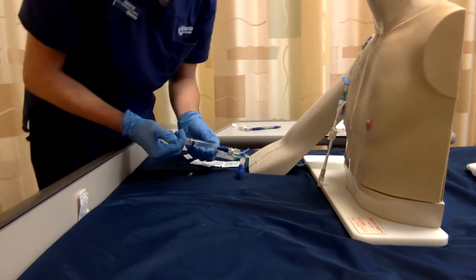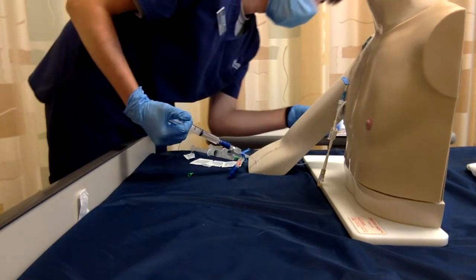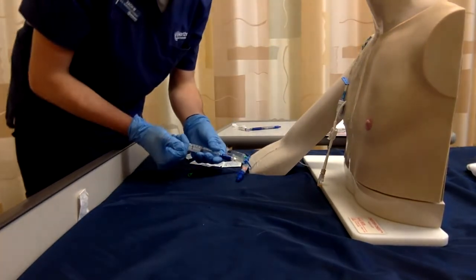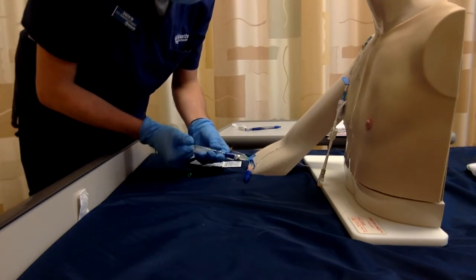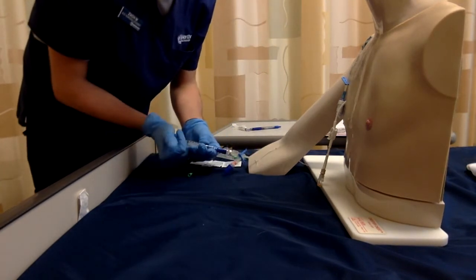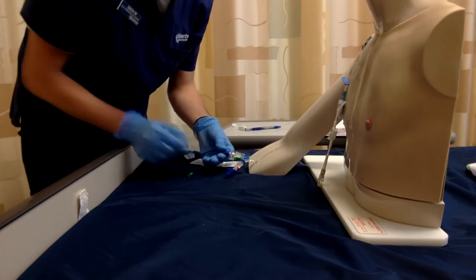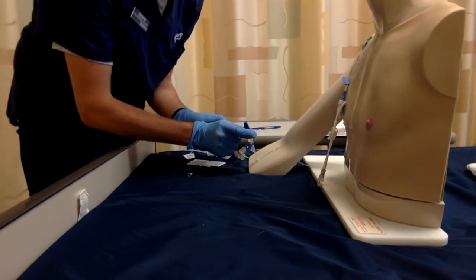Okay, that's one in there. Oh, it fell out. Yeah, it did. Yeah, it just sits together like this. Okay. I'm going to clean my site again.